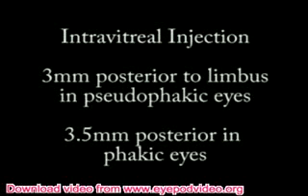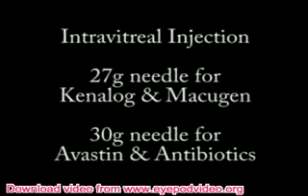We normally inject three millimeters posterior to the limbus in pseudophakic eyes and three and a half millimeters posteriorly in phakic eyes. We typically use 27 gauge needles for Kenalog and Macugen, and 30 gauge needles for Avastin and intravitreal antibiotics.